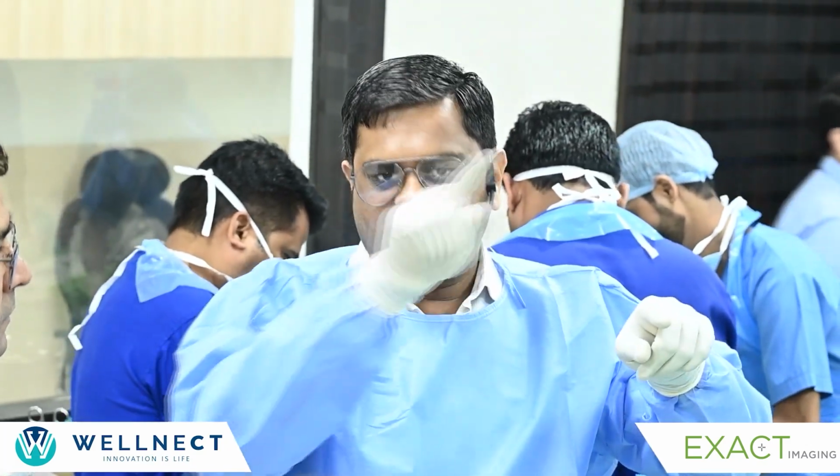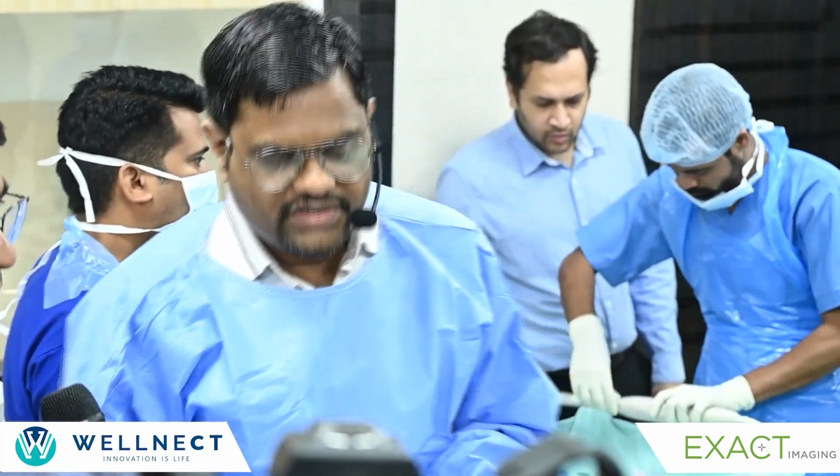And the last thing I want to tell is, suppose you have done a TUR of this patient and the patient comes back with poor flow, then if you do a transrectal ultrasound, you can actually see the defect in that prostatic fossa and you still see that there is something which is jutting at the bladder base or at the apex. There is some nodule which is present. That means that is causing poor flow in this patient and maybe you will have to go and resect the fossa again. So that is an important one.